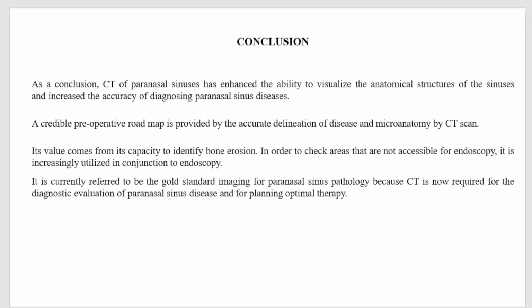And the conclusion: CT of the paranasal sinuses enhances the ability to visualize the anatomic structures of the sinus and increases the accuracy of diagnosing paranasal sinus disease. Its value comes from the capacity to identify bony erosion. In order to check areas that are not accessible by endoscopy, it is increasingly utilized in conjunction with endoscopy. It is currently referred to as the gold standard imaging for paranasal sinus pathology, because CT is now required for the diagnostic evaluation of paranasal sinus disease and for planning optimal therapy.